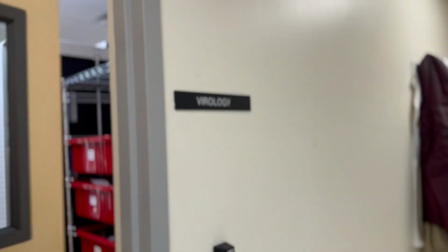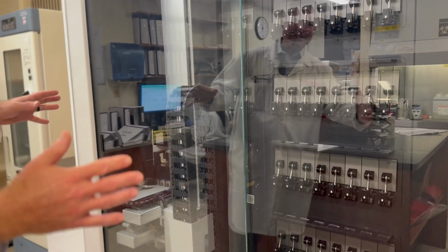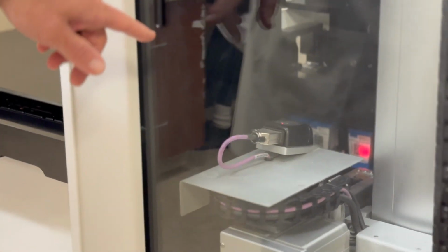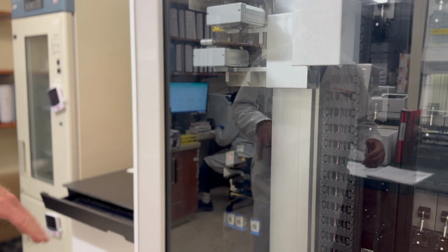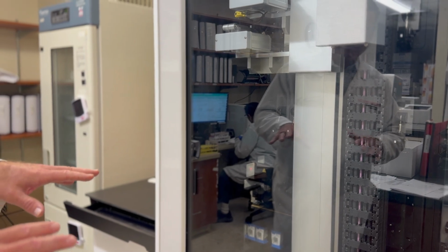Come on in. This is virology. So in this section of the laboratory, we mostly do virology testing. However, there are some bacterial targets that we test for too. And essentially everything that we do here is a molecular technique. What you can see over here is a Cepheid GeneXpert instrument. It's got many, many slots in it that are able to hold cartridges, some of which you can kind of see queued up for testing over here, the little blue cartridges that are barcoded. This allows us to do molecular testing for a variety of different targets, such as C. diff, influenza, RSV, COVID-19, etc., on demand, individually, one at a time, in each of these little chambers.